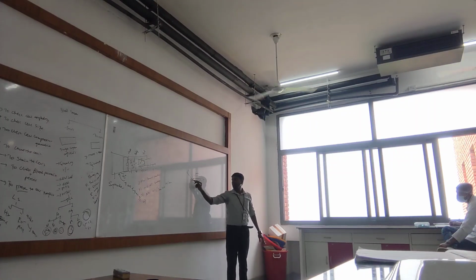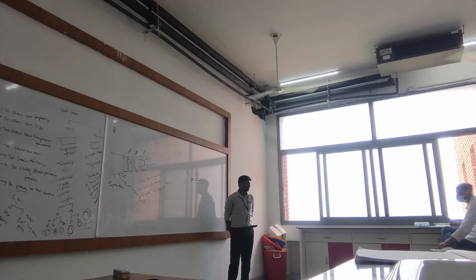Technically, you should end up with a tongue smear. If you didn't get a tongue smear, what might be the reasons? Dust, air bubbles, greasiness, lack of proper angle, leading to no tongue smear. So that is all about thin smear preparation.